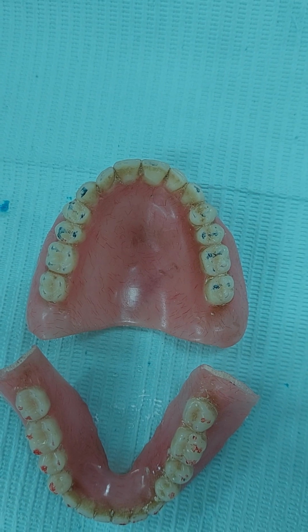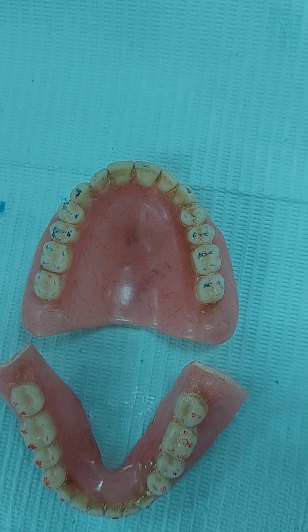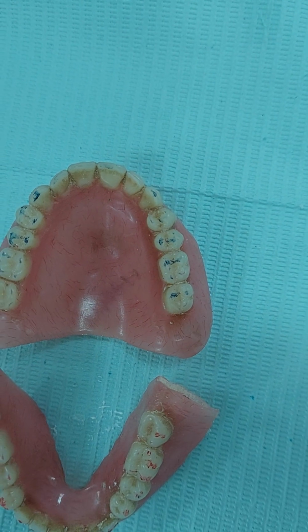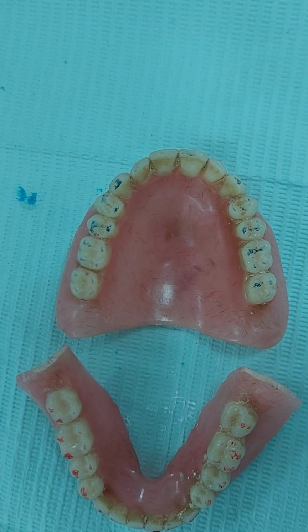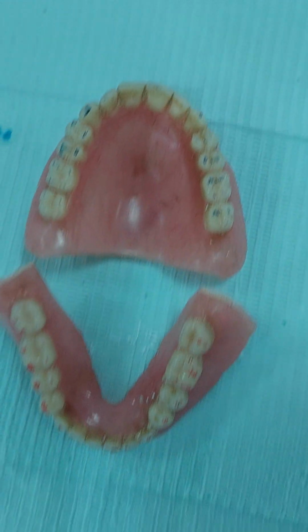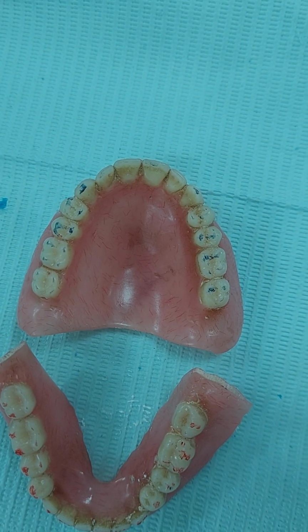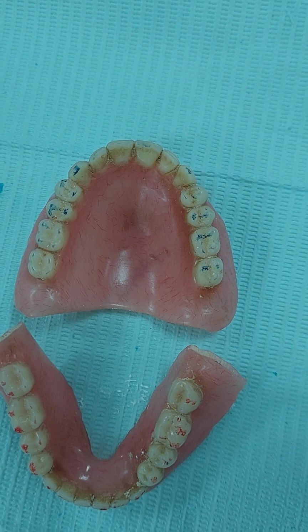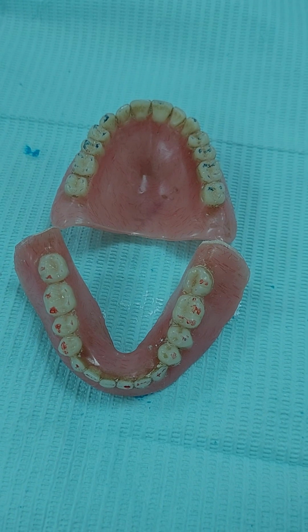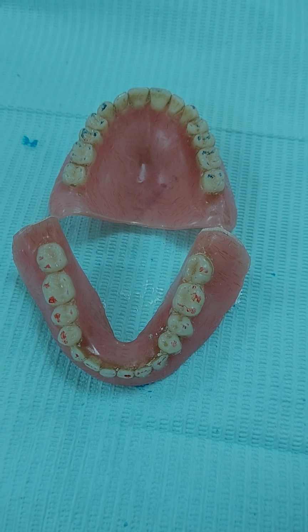I should not have heavy spots on the upper. So what am I going to do here? I'm going to reduce the heavy bites on this upper right side of the patient, and I'm going to leave these here because they are equal, but here they are not equal. And the dots on the canine, I'm not going to change them here. I'm going to change them in the lower, to keep the morphology of the teeth, and as well keep their position. So all of the adjustments I'm going to do on the lower until I see all anterior teeth having a bite that's light and equally distributed. This is in protrusion.